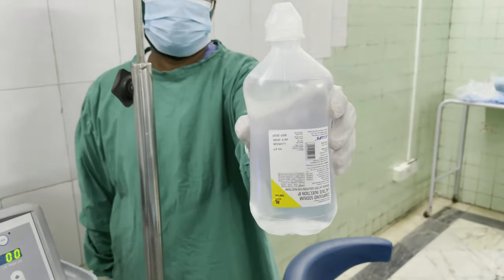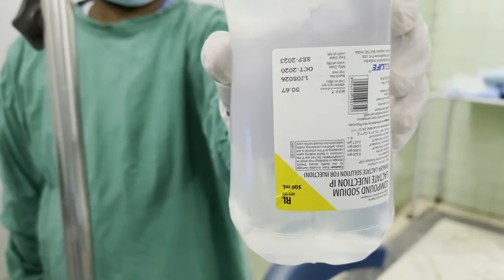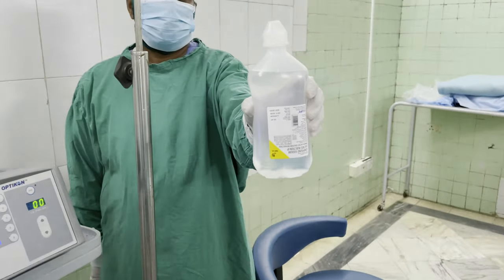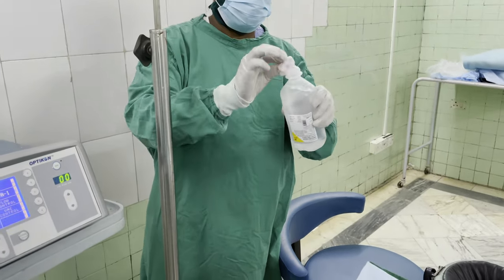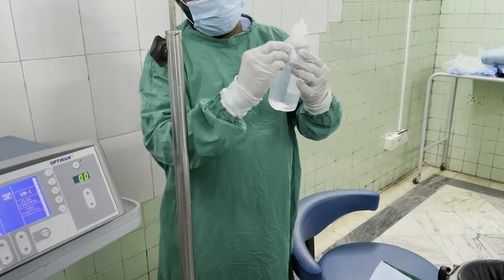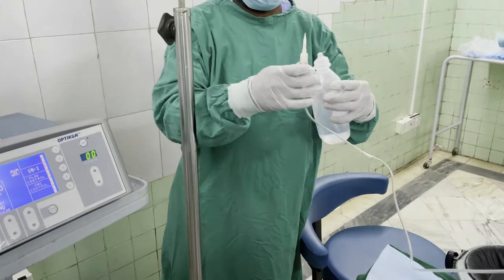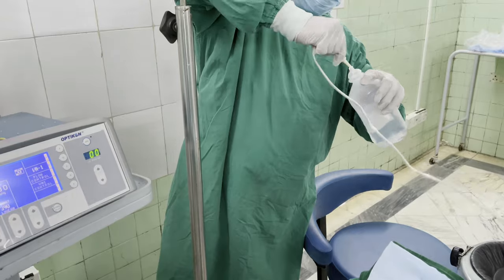Now the setup of the IV fluid, which is used for hydrating the cornea and for procuring the fluid for the hydro procedures. As you can see, we check the expiry of the ringer lactate solution, and now we set up that bottle. The lid is removed and the tip is cleaned with spirit. So also the rest of the bottle. And then the sister hands the other end of the IV set to the assistant, who now pierces the bottle and gets it ready for use during the surgical procedure.